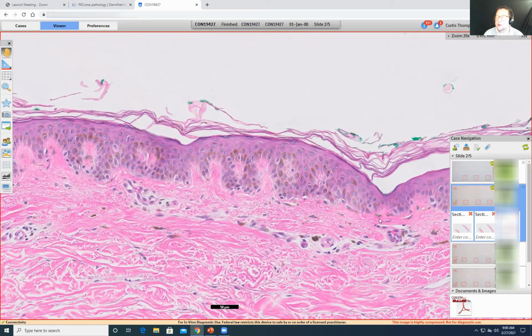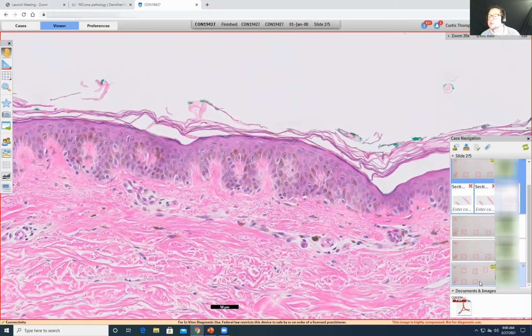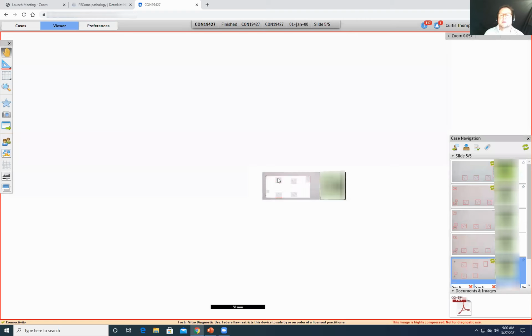So in melanoma in situ, we like to see confluence. So they run over here, they run here, they run here. So basically it's an anaplasia back to an embryonic behavior when the neural crest melanocytes are populating the epithelium. So that's what melanoma in situ is. So here, when they're just on the rete, it's less worrisome, and that's one thing we're looking for in benign versus malignant.